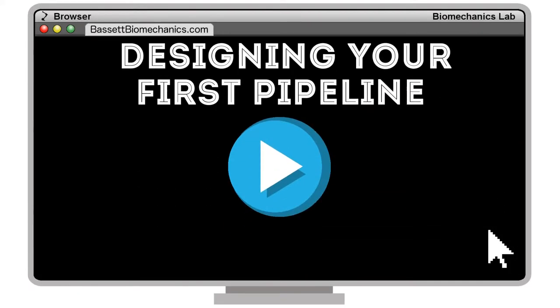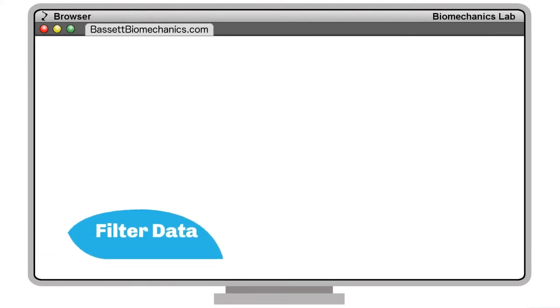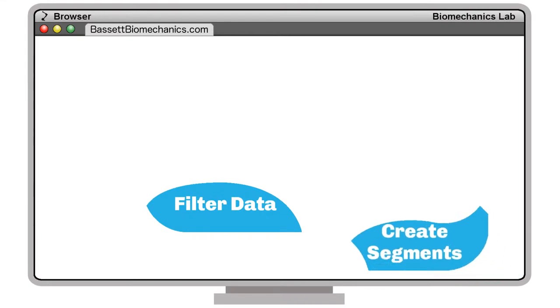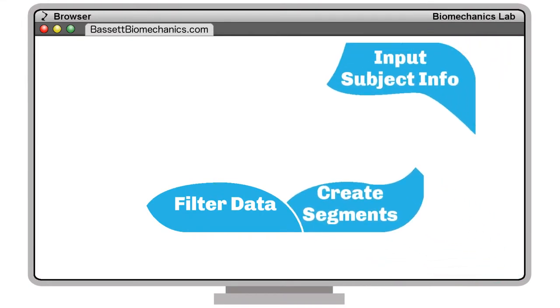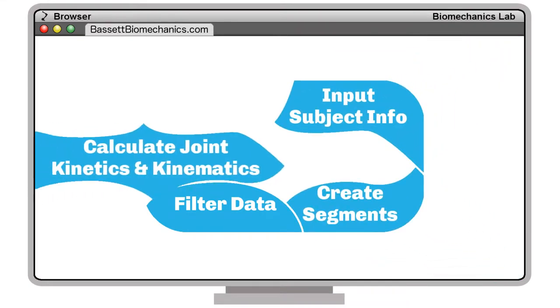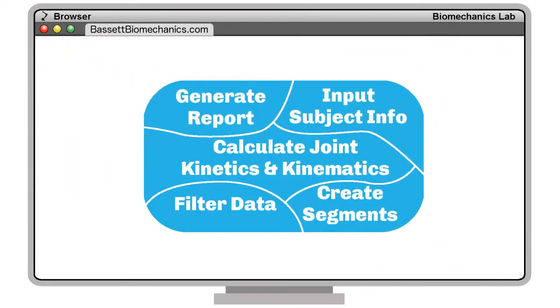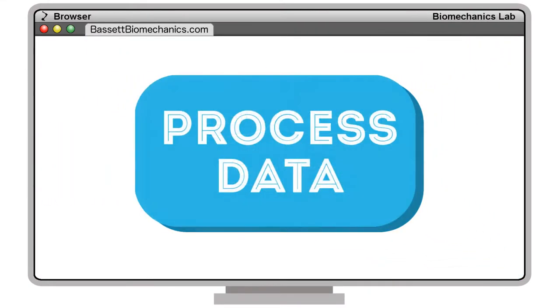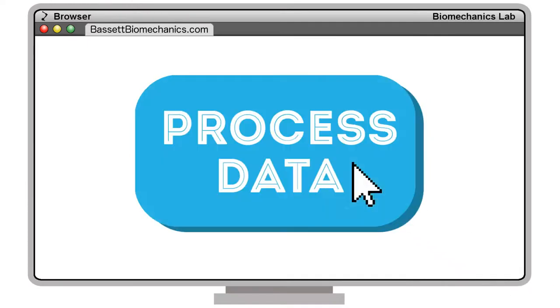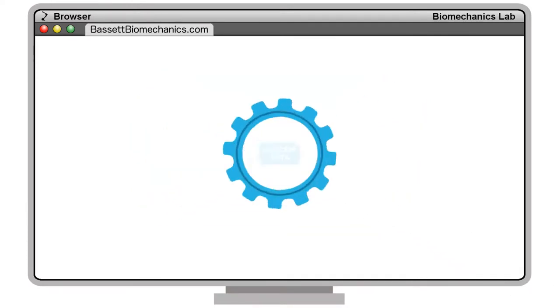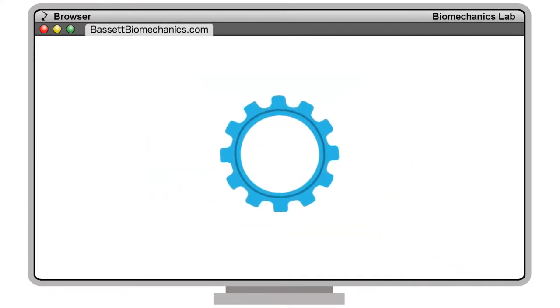Most importantly, we teach you how to completely automate all of your data processing through pipelines, ensuring that every single patient is analyzed the exact same way every single time.